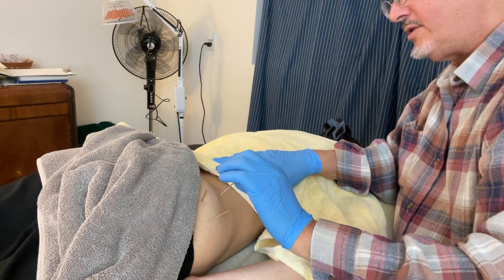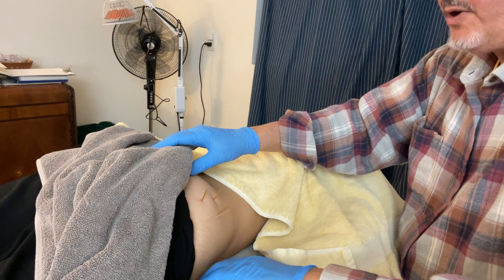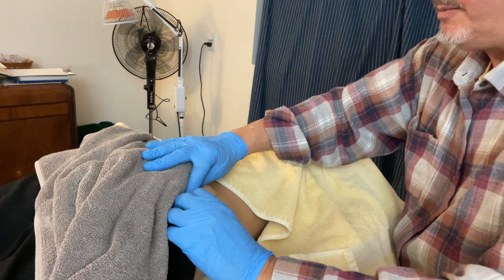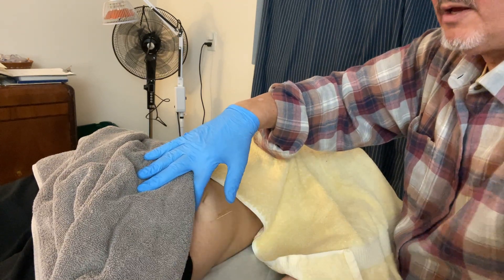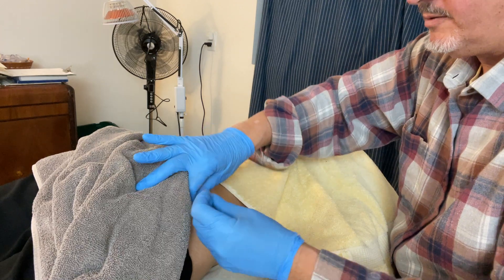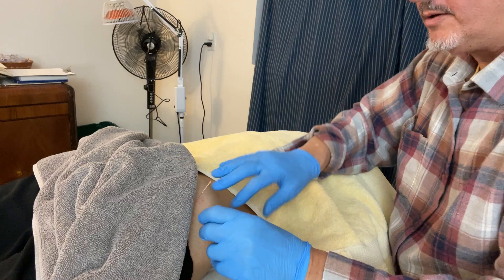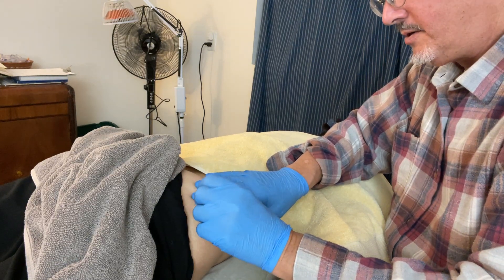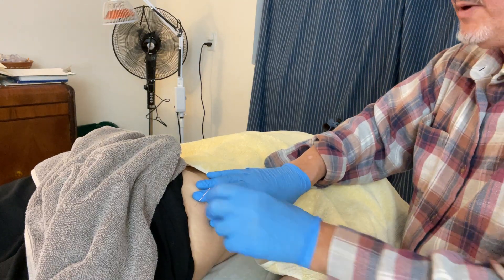That was a good one — I could feel it move all the way there. Let's try the piriformis and see if it needs help or not.